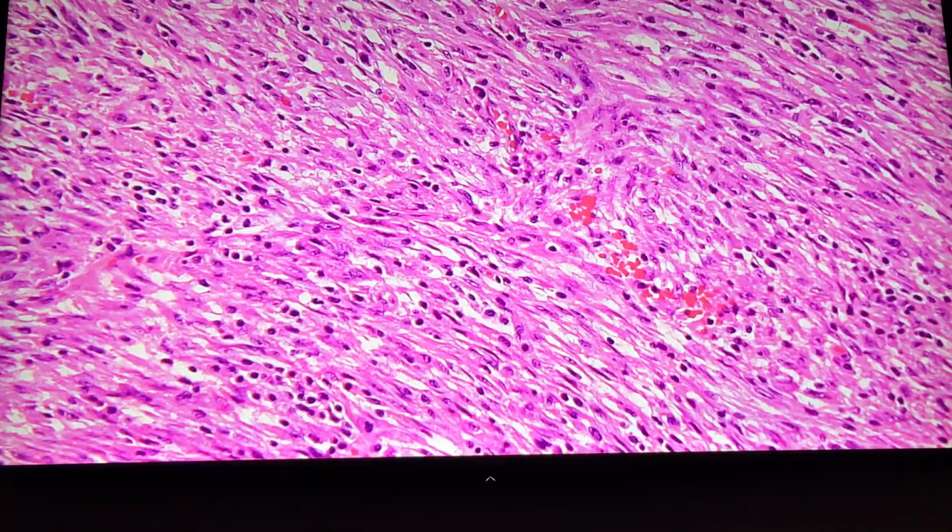You should know there's a recent paper that says you can also get ALK positivity with the D5F3 in angiomatoid fibrous histiocytoma. So that's a pitfall, but those usually don't look like this. There's a morphologically different look. So most of the time that's not a problem, and the pickup is higher. Plus you can do another thing, which is ALK FISH, and that will pick up some.